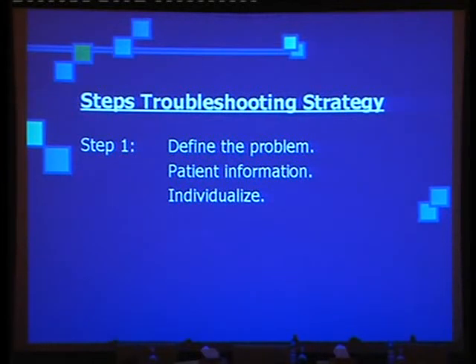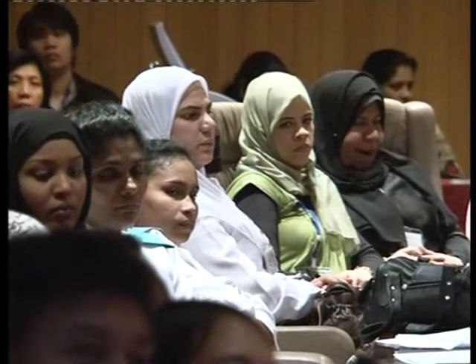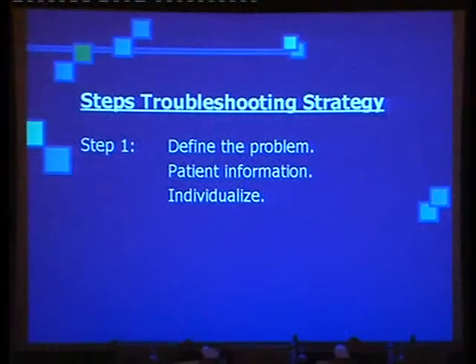I will give an example: a patient with complete heart block. If the heart rate over there is 40, and the nurse called me and said the pacemaker did not work, I will just go over there and see the ECG. If the pacing spikes are wandering everywhere and the heart rate is low, like 40, then definitely there is a miscapture. That definitely is a problem. But if the patient, in reality, has sick sinus syndrome, and the rate is like 70 with no spikes on the ECG, this can be a normal phenomenon.